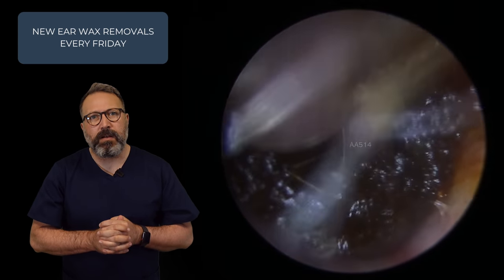Two and a quarter inches, five and a half centimeters. This was a really chunky bit of wax — such a hard piece. You can see I've got it to the outer part of the ear canal, and there's this thin layer of dry skin to the right-hand side underneath it as well. Is this going to come past? It's not really, so we're going to pop the Jobson Horn in to get this out — aim for the top, sneak over the top of the wax with downwards and forwards pressure. There you go, out that rolls. So much easier with the Jobson Horn for that particular type. It's breaking down a little bit as we're taking it out — look how when it's not confined by the shape of the ear canal, it starts to almost open up like a flower as it comes away.